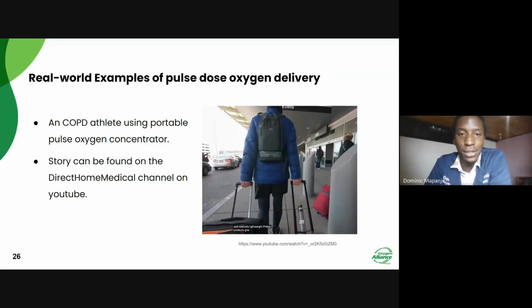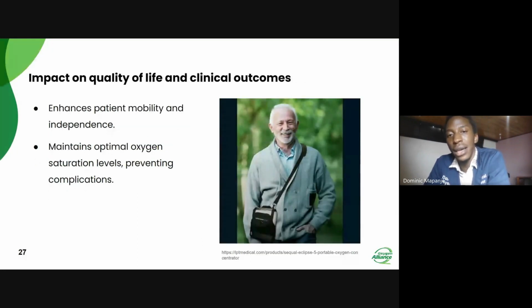On the impact these devices have brought, we have seen that they are efficient and lightweight. You can carry them around, and they bring comfort since they are small, unlike those traditional oxygen concentrators that you cannot move around with. So this enhances patient mobility and independence. They can go about their day carrying that small oxygen concentrator using pulse-dose.